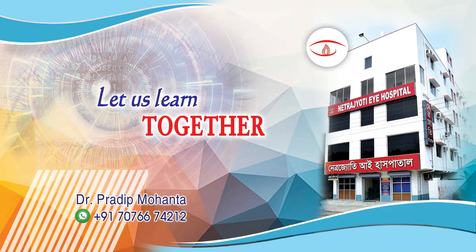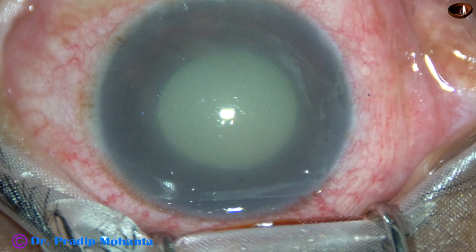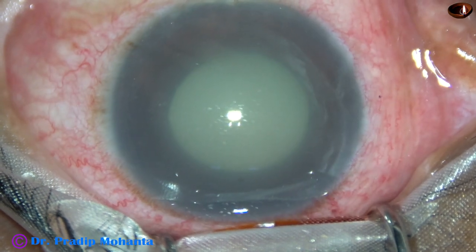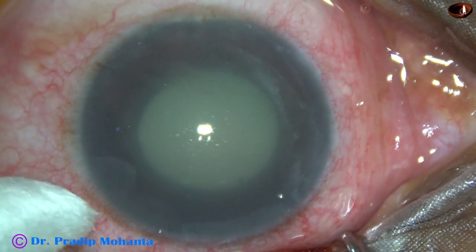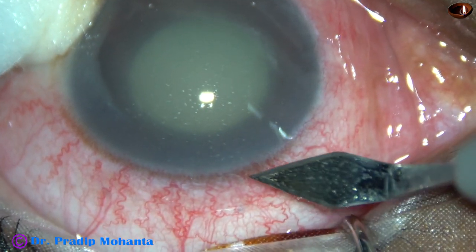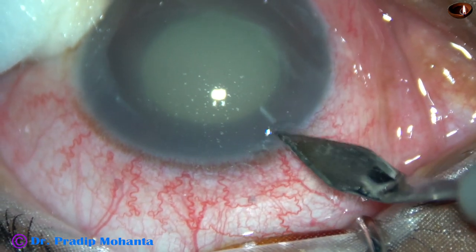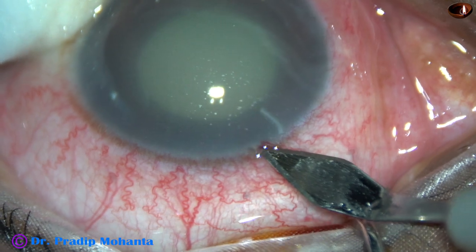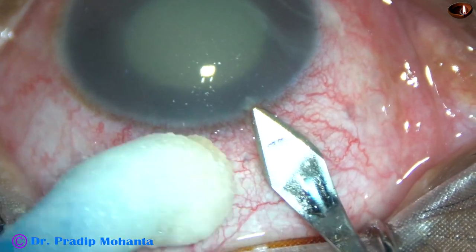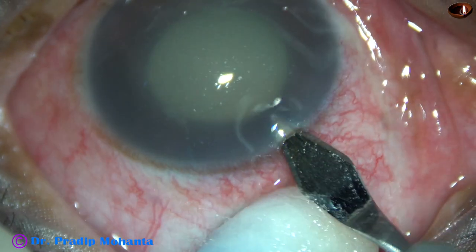Friends, welcome to my workplace at Ranaghat, West Bengal, India. This is a case of phacolithic glaucoma. The patient presented with pain, redness, vomiting, and high intraocular pressure. IOP was 56 mmHg; with intravenous mannitol and other anti-glaucoma medications, the pressure has come down to 36 mmHg, and I have taken out the case for surgery.